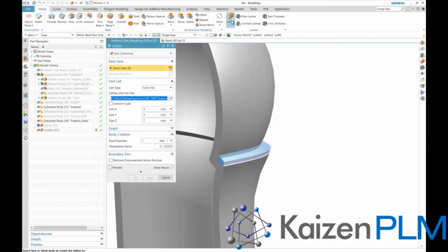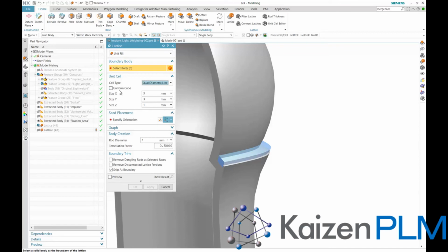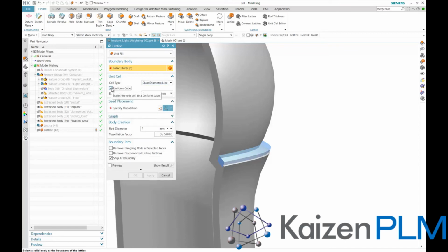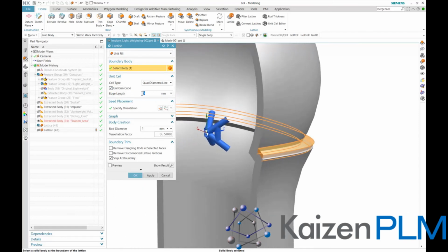We once again evoke the lattice function and change the lattice type to something more suitable. Here we will use the quad diametral line option. We also change to utilize the uniform cube definition. As the edge length is way high in relation to the size of the fill volume, we reduce the edge length to 1. With the edge length set to 1, the rod diameter also must be reduced to obtain a good lattice.